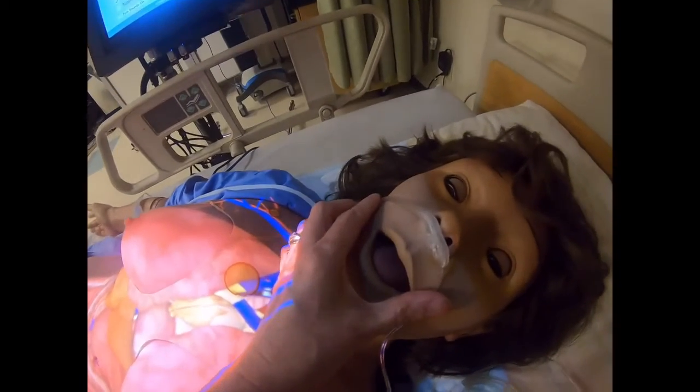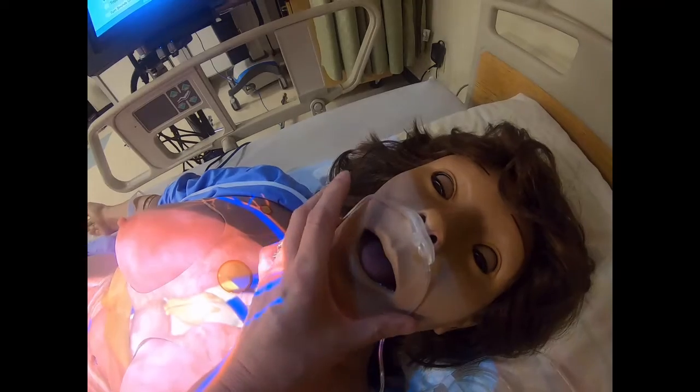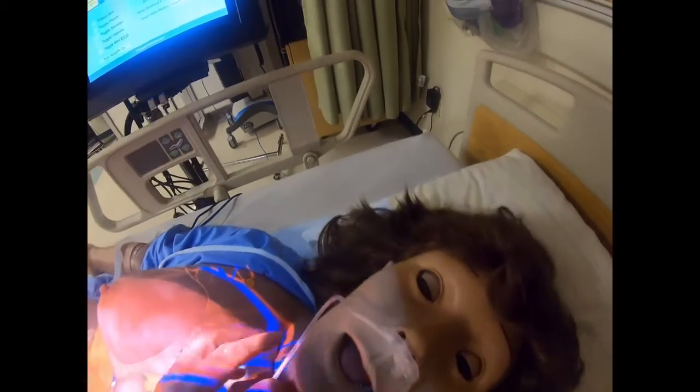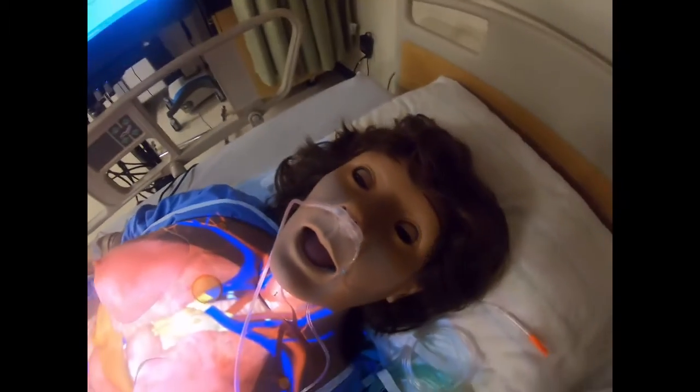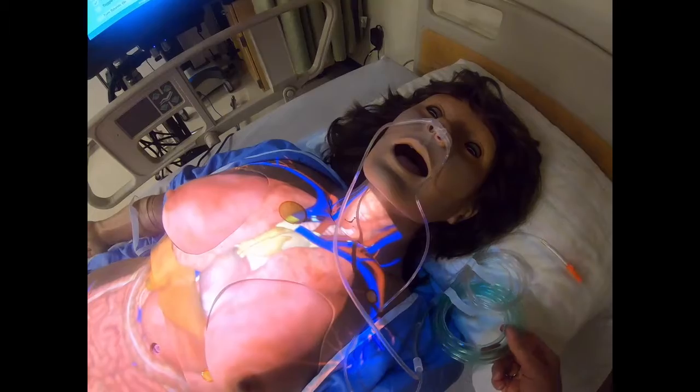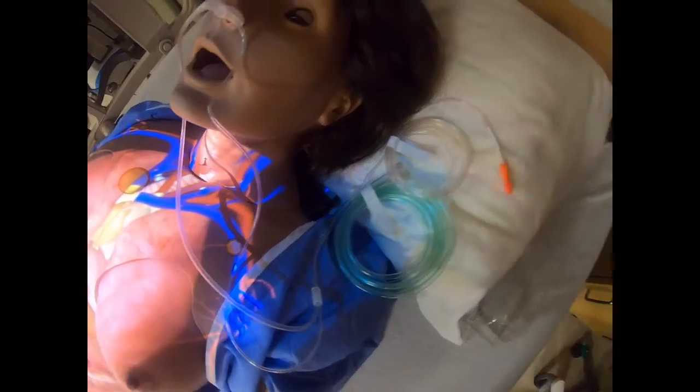So we go ahead and apply that into my patient's nose, and we will wrap it around the ears of our patient to keep it in place. And then we'll go ahead and take this end and connect it into our monitor. And we can also connect it to oxygen if necessary with this port here.